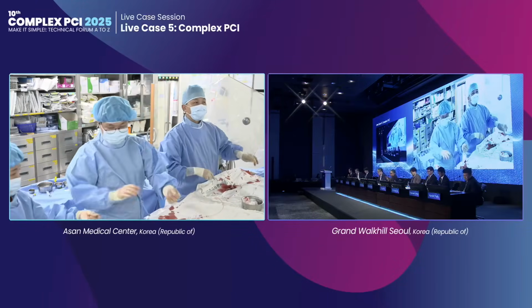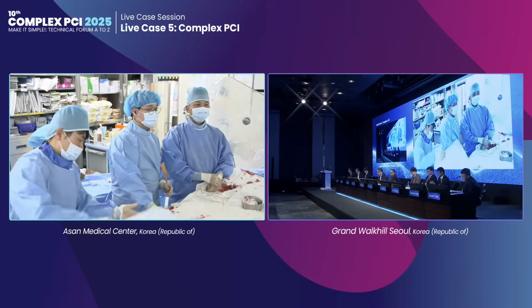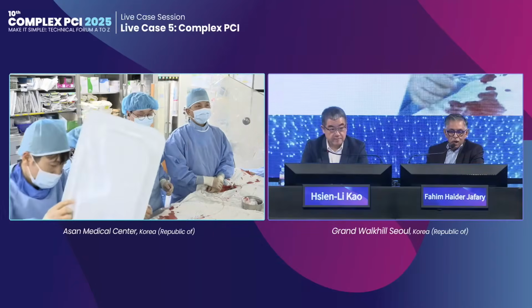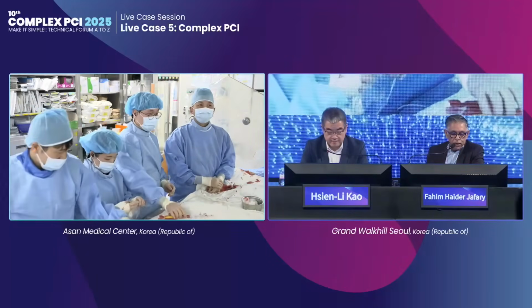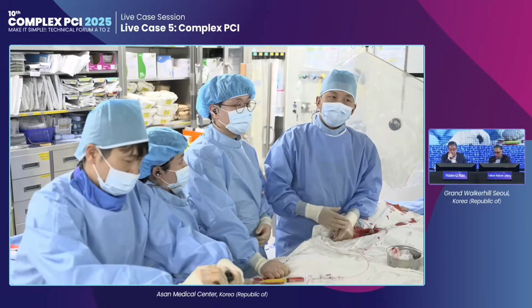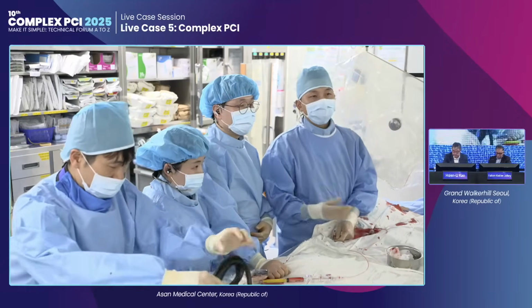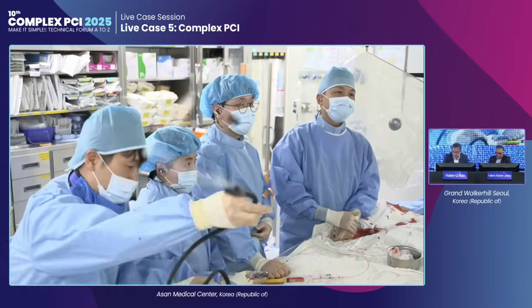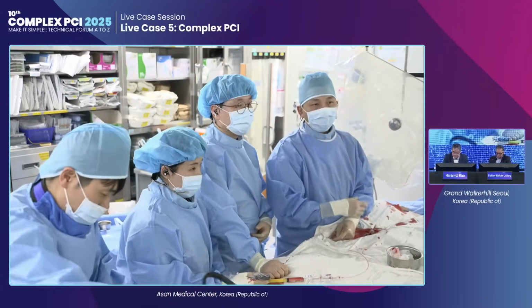Dr. Kang, Fahim Jafary and Paul Kao here. Can you hear us? Yes, I can hear you very well. Super. Well, thank you for the case, and tell us about your case, please. Yes. I'm Dr. Do-Yoon and our senior fellows Kyung-Won-So and Sung Park, and our senior technician Jin Sung-Mo will join this procedure. Can you please briefly talk about the case?